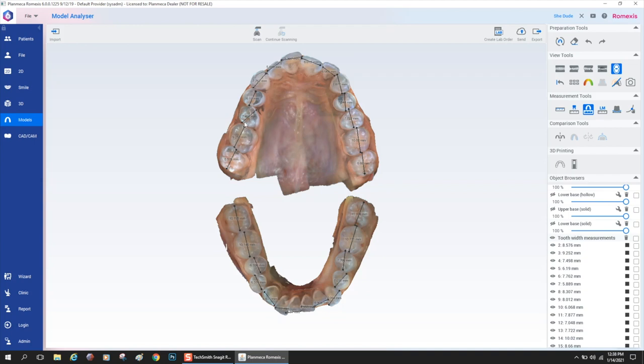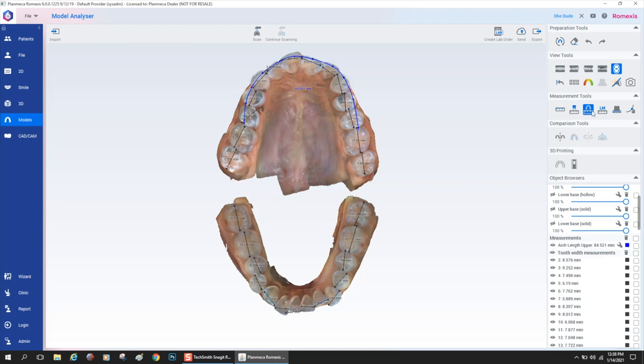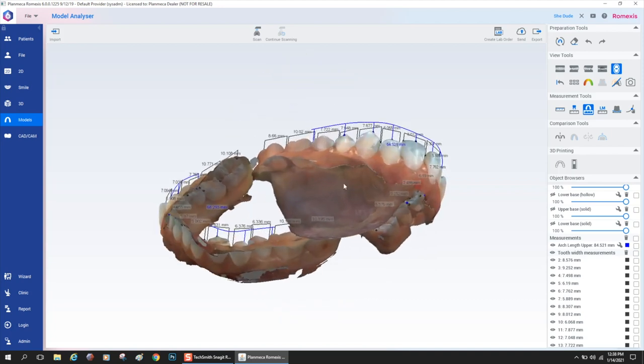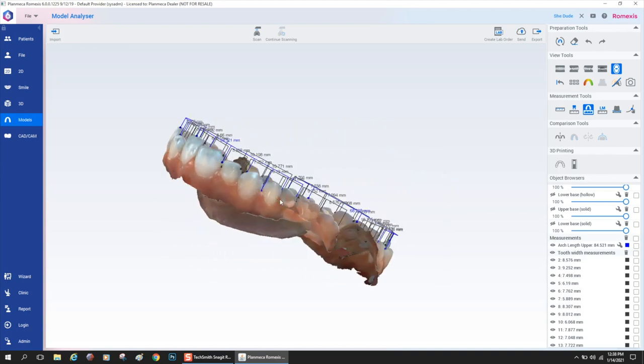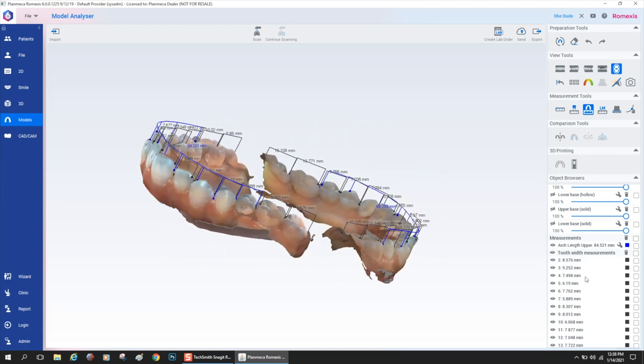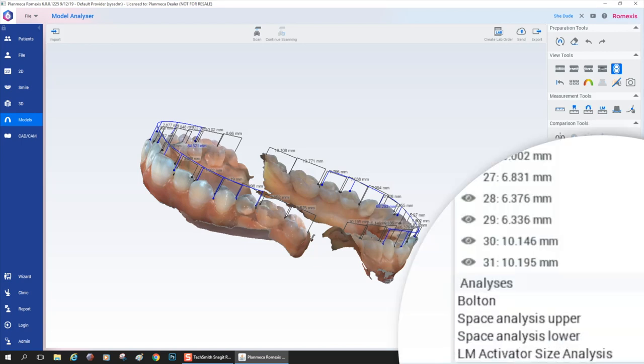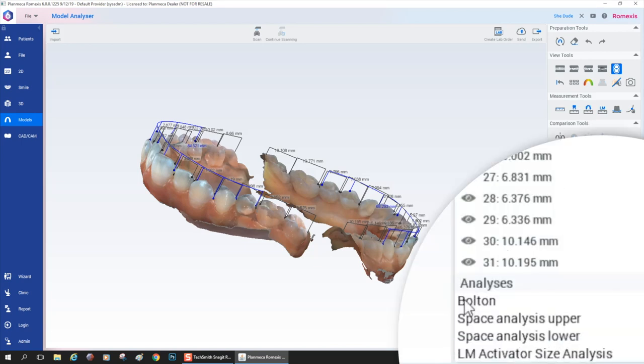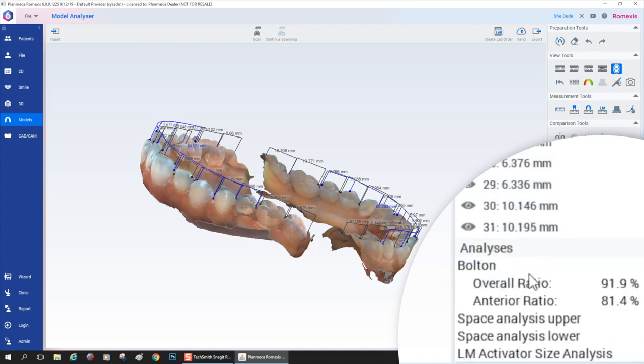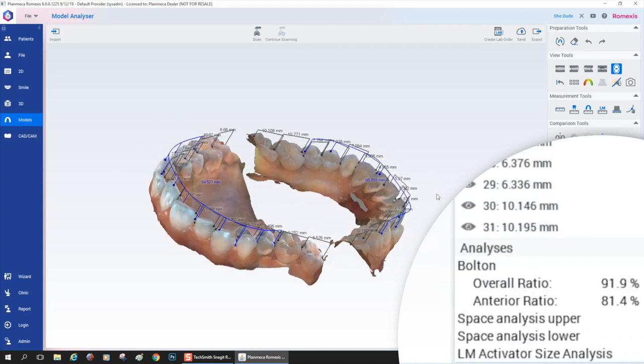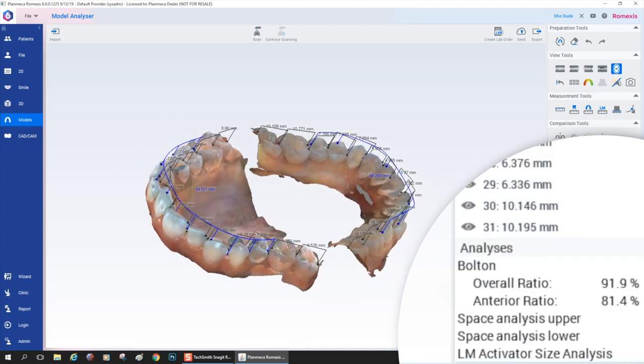Now we have the tooth size analysis. Now we're going to go to the next tab, which is the arch size. It's the mesial contact point of the first molar. You're splitting the differences of the ideal arch form here, ignoring extreme variances. You're going to go to the mesial contact on the contralateral side of the first molar. Click on and off. You click it off and then click it back on. Then you're going to do the lower. When you click it off, it saves it.